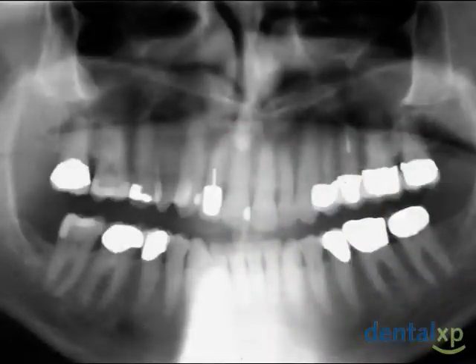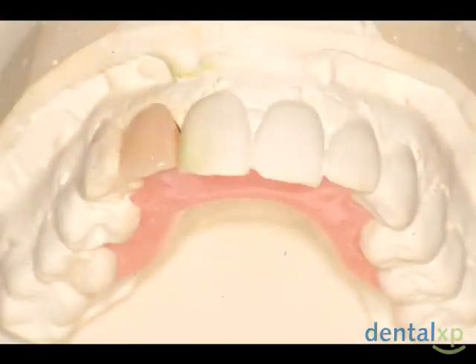The first case shows how a proper emergence profile can be created with a provisional implant crown. The crown post and core became loose on the maxillary right lateral incisor, resulting in decay of the canal and the remaining tooth structure. The tooth was unrestorable. An implant was placed, and the patient wore the removable provisional appliance during osseointegration.